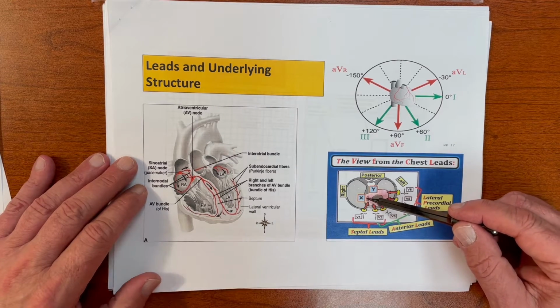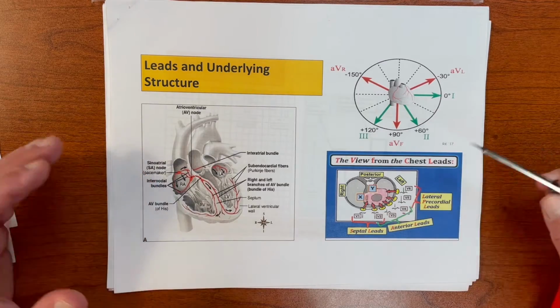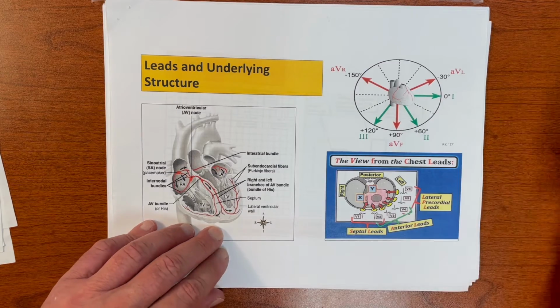Therefore, in an acute process like that, what would we assume in V1, using the basic laws of electrocardiography? V1 all of a sudden might experience these big, large forces as there's more of the right ventricle under that lead and everything is going that way.